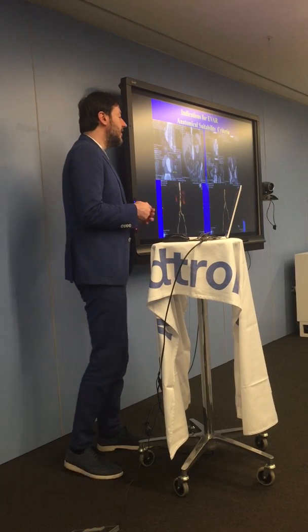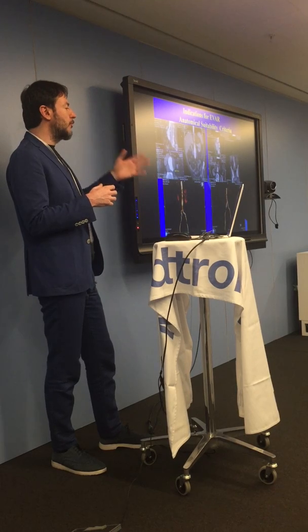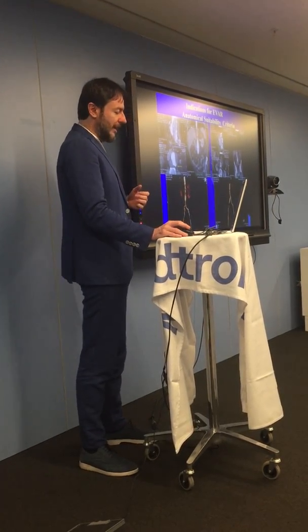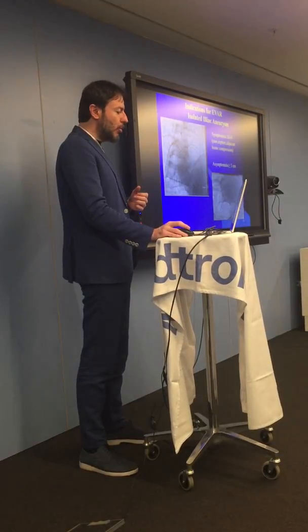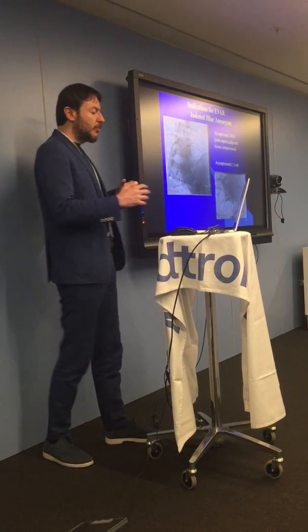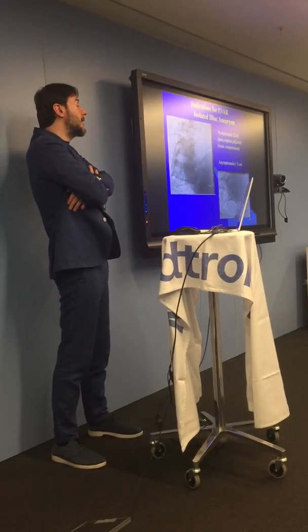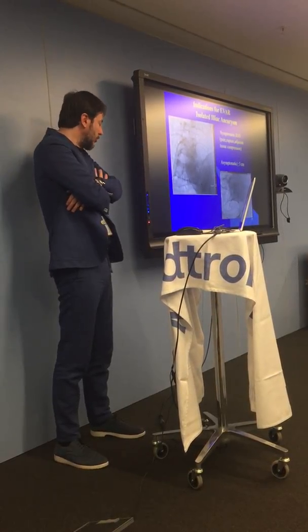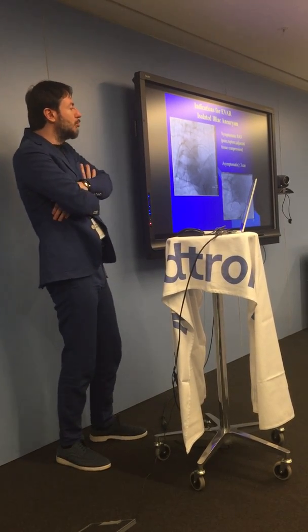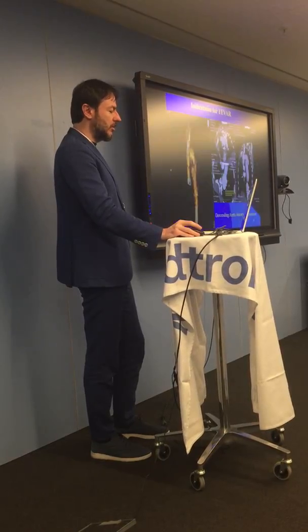We will go case by case, and together we will measure the diameters and how to decide which case is suitable for endovascular repair and which one is not. So we have the issue of how to treat the iliac aneurysm, which is a very debatable issue, and we don't have any on-label devices for this pathology. So we have improvised techniques and improvised solutions. Maybe we can also give you some examples about that issue.